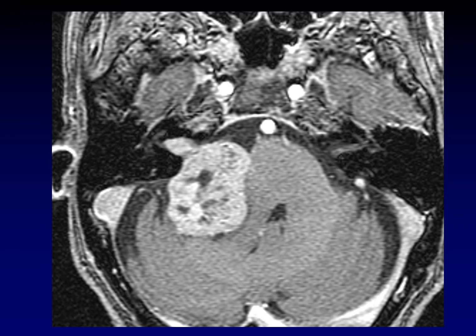Here is a classic example of a vestibular schwannoma. You'll notice that I'm going back and forth between the terms vestibular schwannoma and acoustic neuroma. Acoustic neuroma is an outdated term, vestibular schwannoma much more precise and accurate, but you'll find that people still use the term acoustic neuroma, and I think it's reasonable to consider them synonyms. So what are the features here that let us know that this is a vestibular schwannoma? Look how it extends deep into the internal auditory canal, completely filling the internal auditory canal all the way from the porus acusticus down to the fundus. And if you look at that porus acusticus and compare it to its counterpart, you can see that it sure has been widened by this mass.